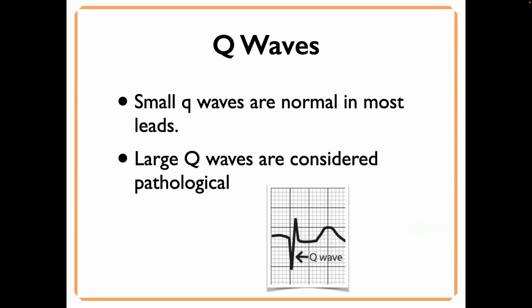Now, Q waves can be considered normal, sometimes called physiologic, or pathologic. So they can be considered normal or possibly diseased, okay?